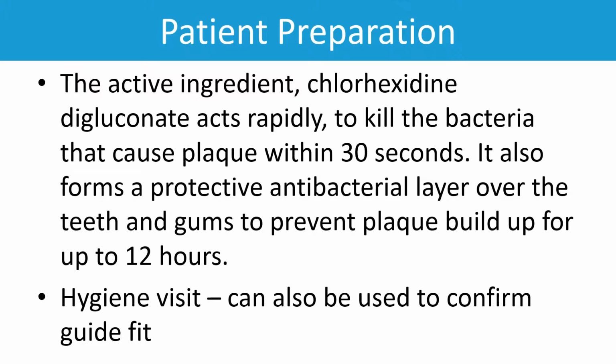And in this case we use azithromycin 500 milligrams, just one tablet prior to surgery, and that's all that we need to do with this procedure. If you can arrange a hygiene visit a week before, that's absolutely marvellous. And also at that pre-visit, what you should do is take the opportunity, if you can, to try the template in the patient's mouth.